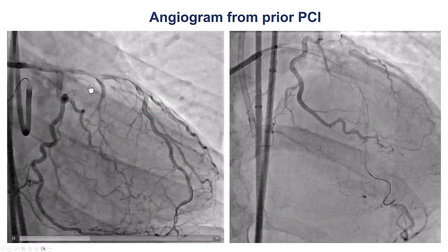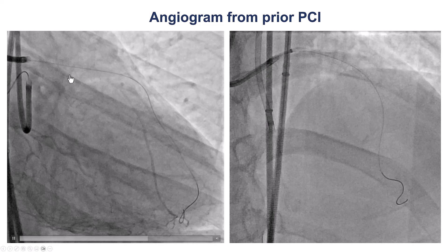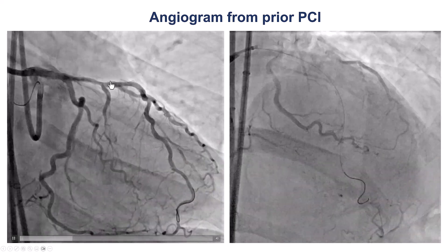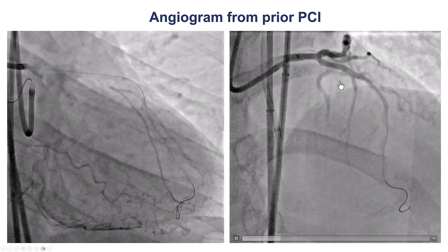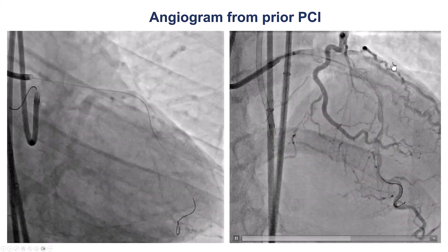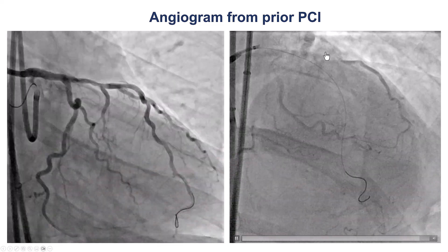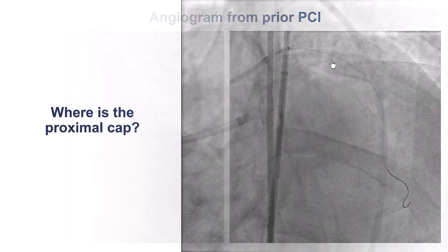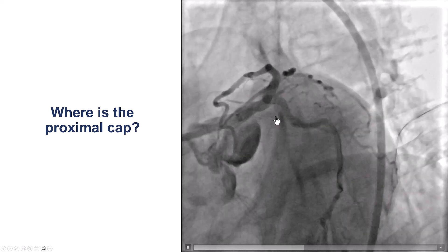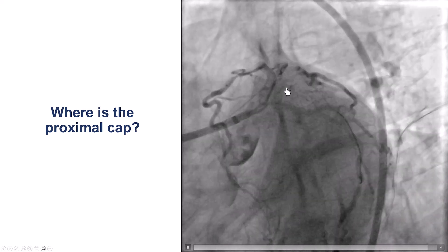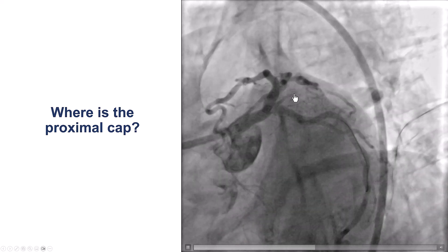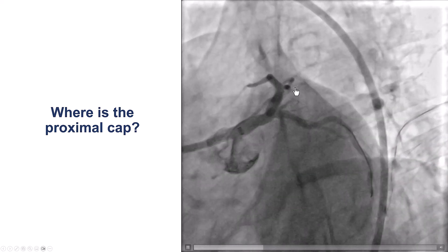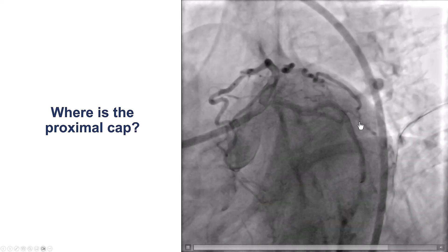However, the origin proximally was not entirely clear. We can see here the circumflex, we can see the LAD — the origin of that branch seems to be unclear. And here we do see the occluded vessel reconstituted distally, but it's hard to understand where it is coming from proximally. This is the spider view, in which we do see a Ramos branch. However, it is unclear where exactly this is going and if this is the one that is connecting with the occluded segment.